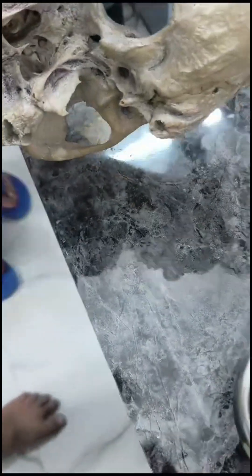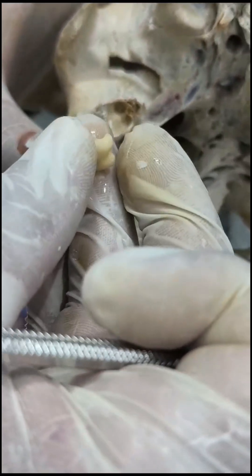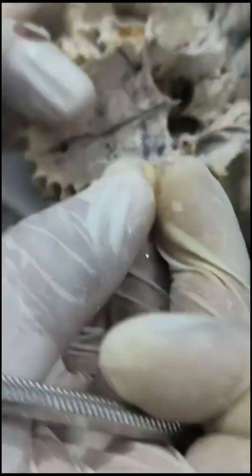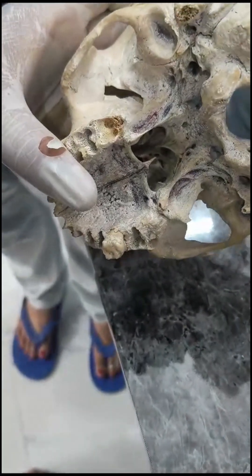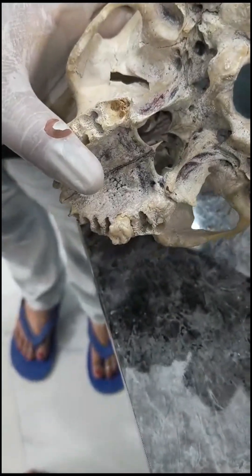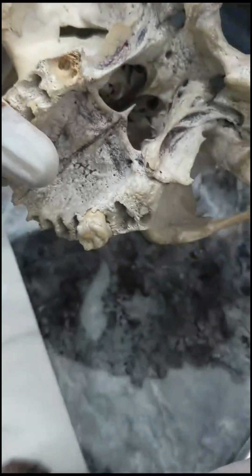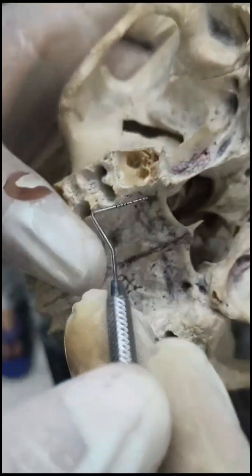As we contemplated, there will be fracture. The root piece has been removed completely and there is a 90-degree dilaceration present on it, so there was fracture of the tuberosity. Because it's a dried skull, even if it was in a patient it would fracture anyway, so that is not the problem.